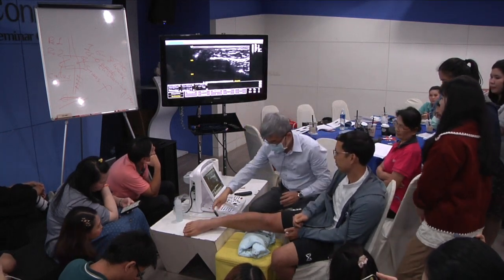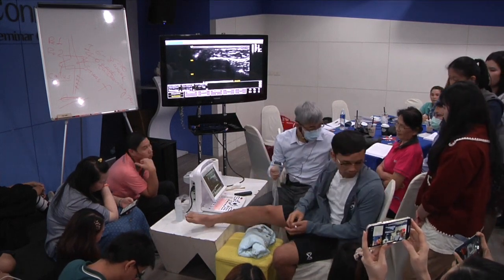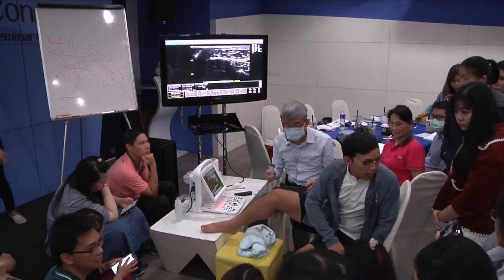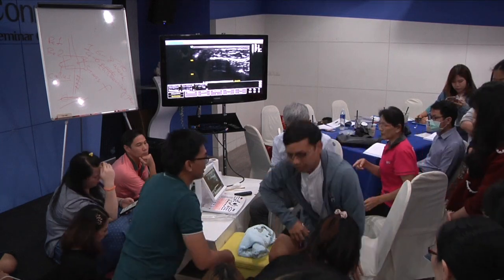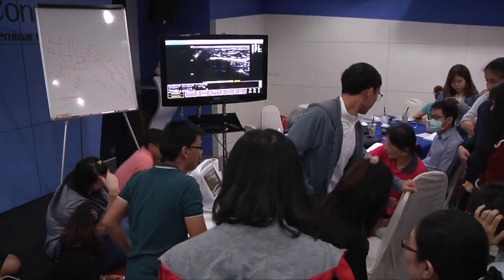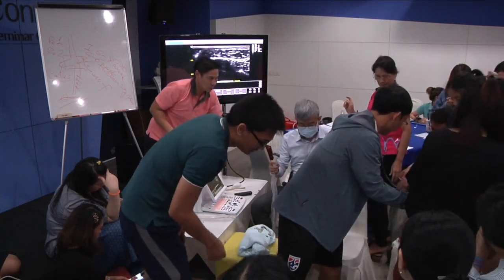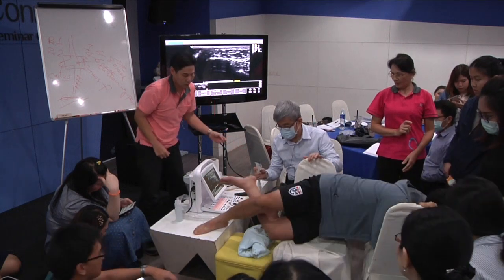Good. So you have to lie down now. Can we give him one more chair? And you need to stand up. Prone. Good.